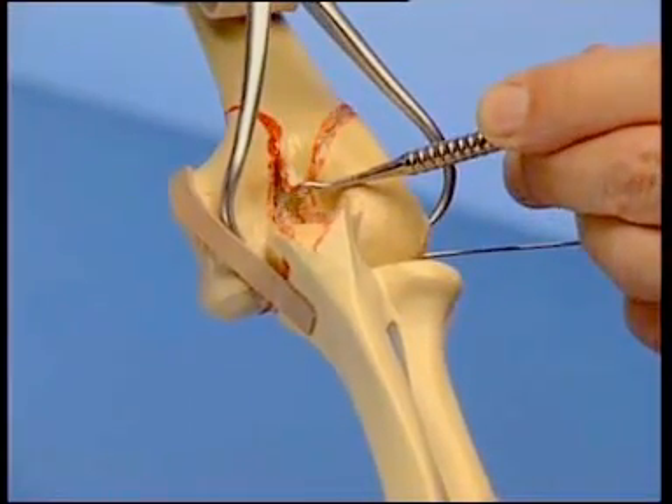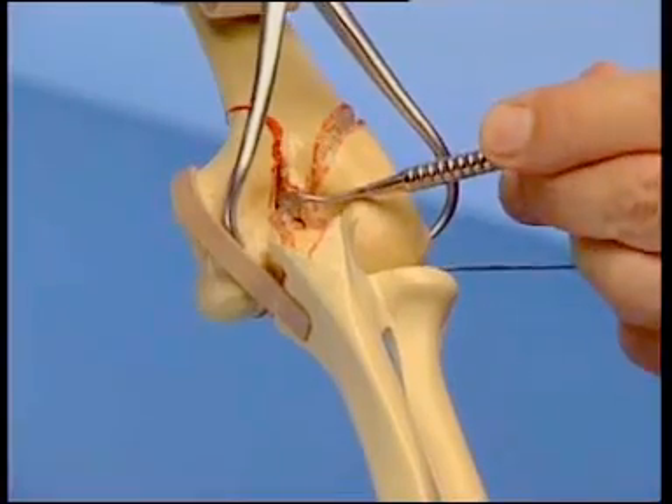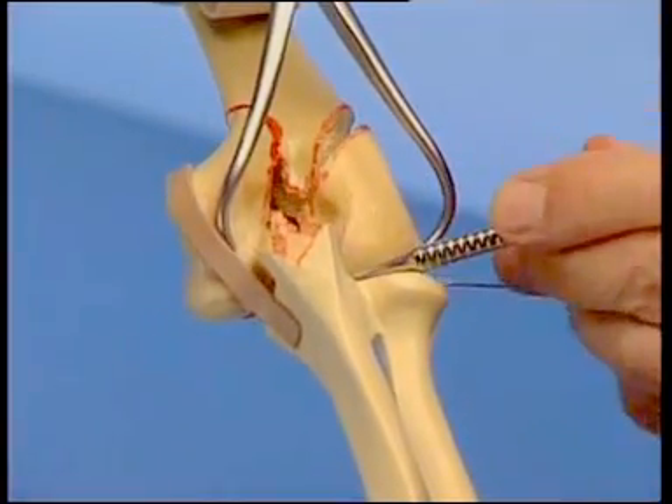The fracture is now anatomically reduced and held in place by a pointed reduction forceps, with care being taken not to damage the ulnar nerve.